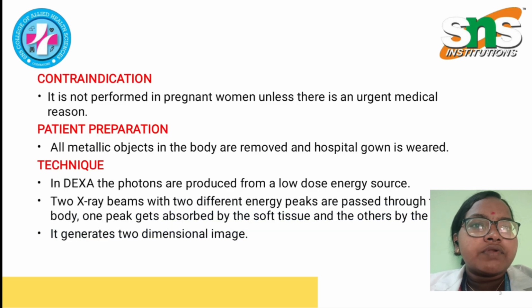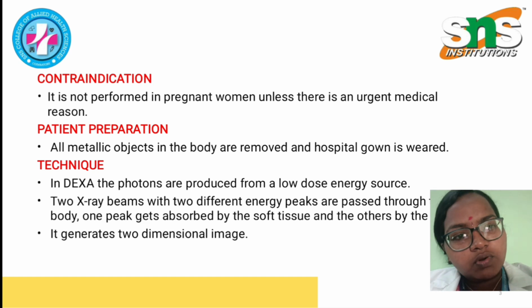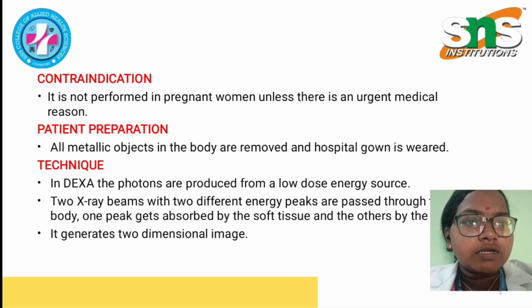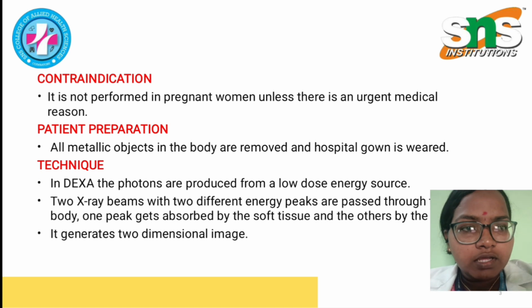The next is contraindication. It is not performed in pregnant women unless there is an urgent medical reason. So mostly it is not performed in pregnant women; an alternate modality is chosen instead, since it is a radiation-related modality. Patient preparation: all metallic objects on the body are removed, and a hospital gown is worn.